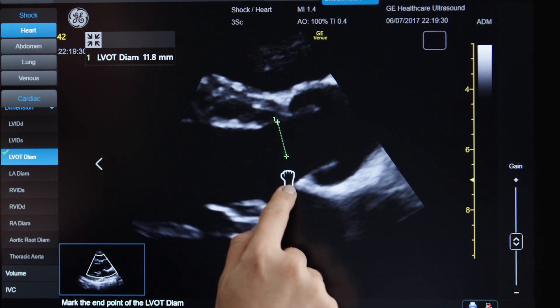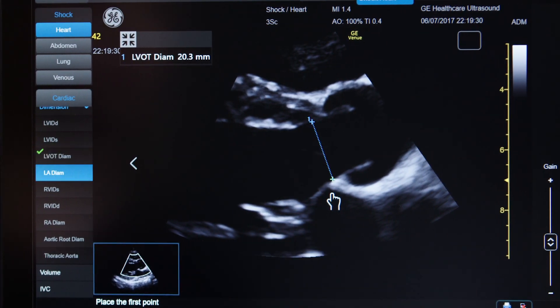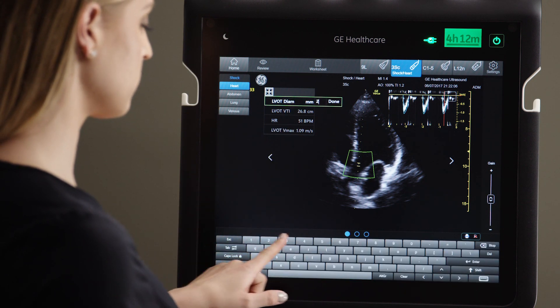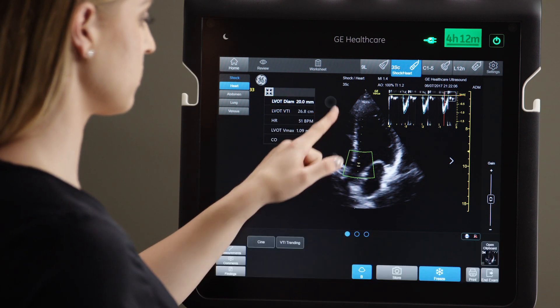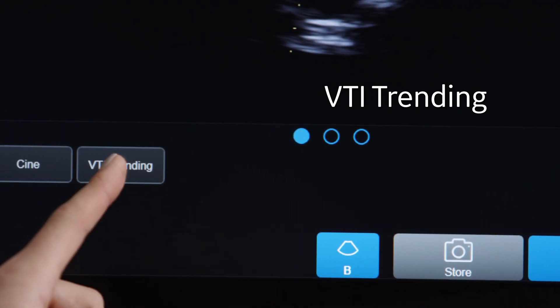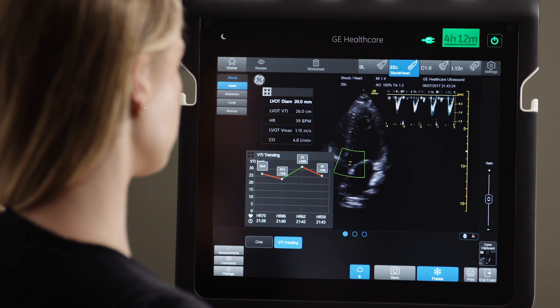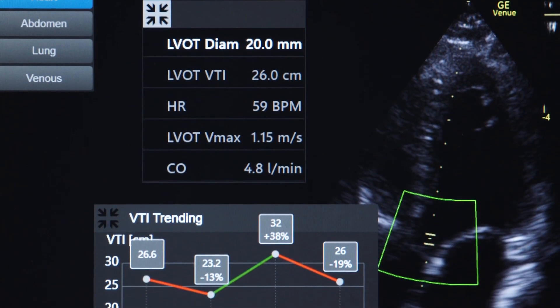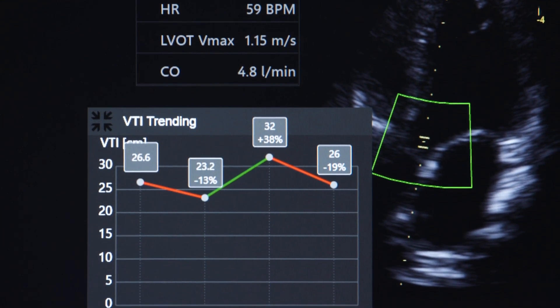If you want to see cardiac output, measure the LVOT diameter or simply type it in if already known. Venue will then calculate the cardiac output for you. With VTI trending, you can trend your VTI calculations, allowing you to quickly visualize the trend and determine your course of action.